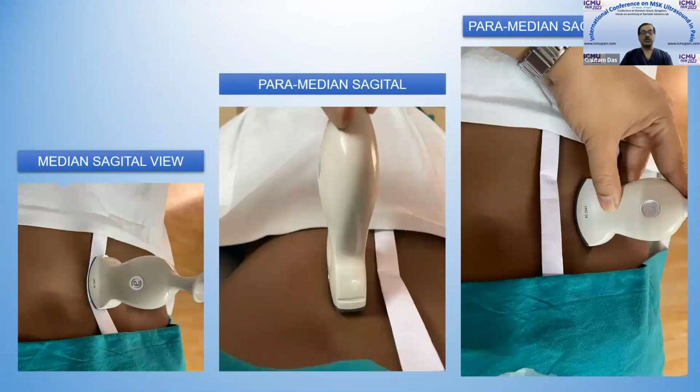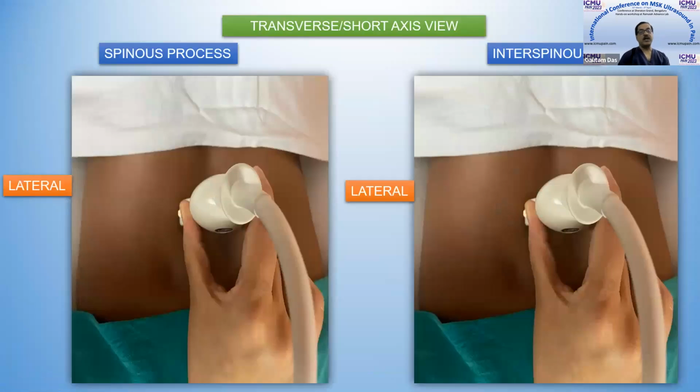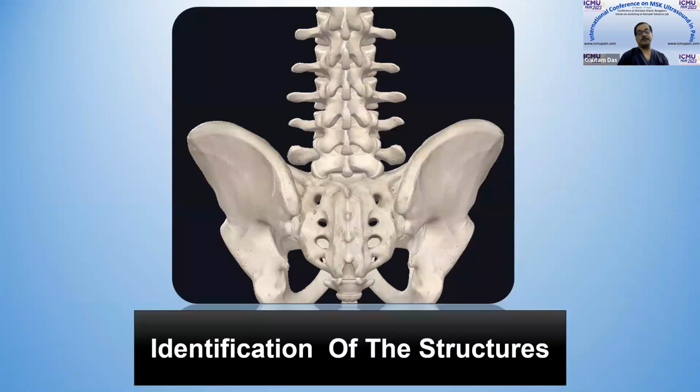Now, position of the probe. Position of the probe can be median sagittal over the midline. Paramedian sagittal is a little to the side of the midline, or it can be paramedian sagittal oblique, which is similar, but here we tilt the probe a little more towards the midline. And transverse is two: one is over the spinous process, another is in between the two spinous processes, where you can find the gap between the two spinous processes and we can see inside the spine.